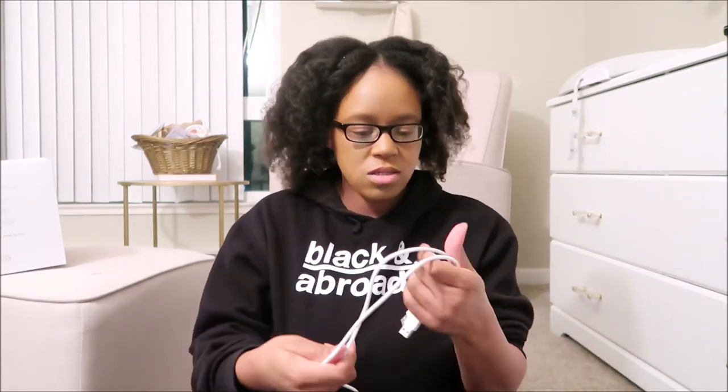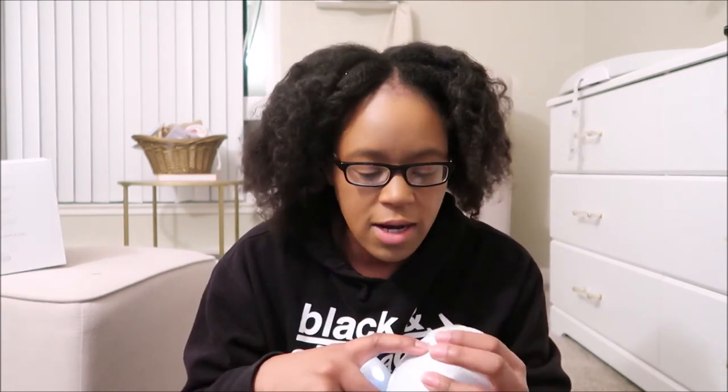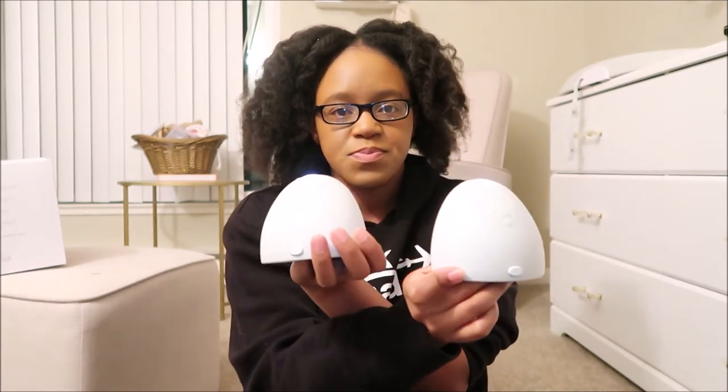I'm just gonna keep these cords in the LV box. Between this, the outlet, the Hatch — there are so many cords and I just can't. So I'm gonna keep this in the box. These use Bluetooth with the app, so I'm gonna go ahead and turn them on. I did pair them already. This one is telling me it's the right side and this one's telling me it's for the left side — so that's how they're gonna go on my body.